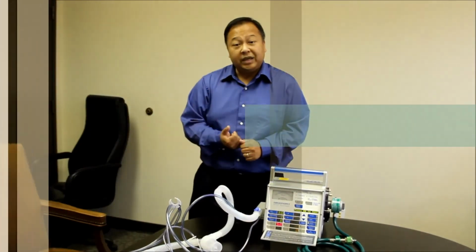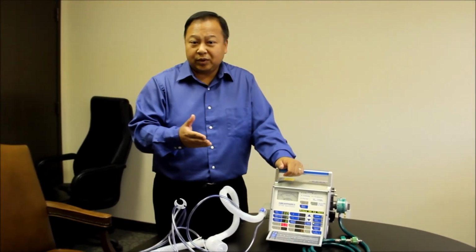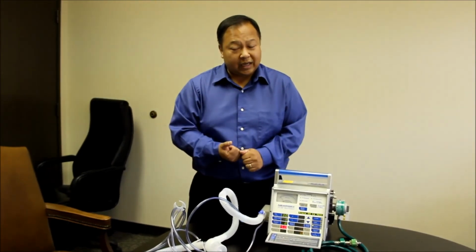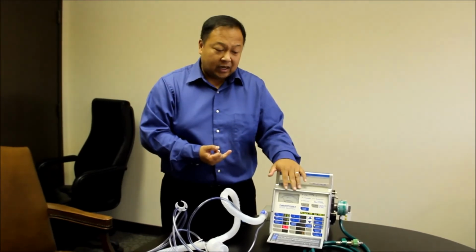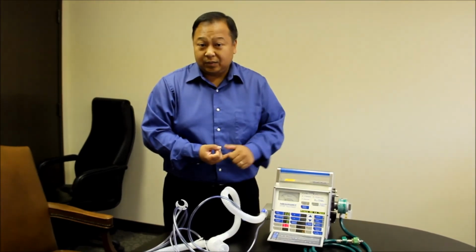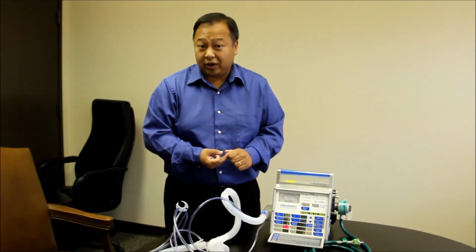We look at the pH, the blood gas. If the blood gas comes back normal, it's 7.35 to 7.45 pH. If that's normal and all the other parameters are normal, that's one criterion we look at. The other criterion is that the patient has to be breathing on their own, in CPAP mode, or T-bar, any of that nature, then the patient can be extubated. And the other thing is their gag reflex and their ability to cough and take in deep breaths.